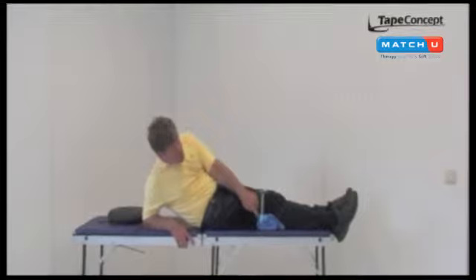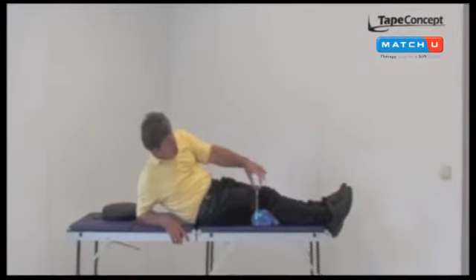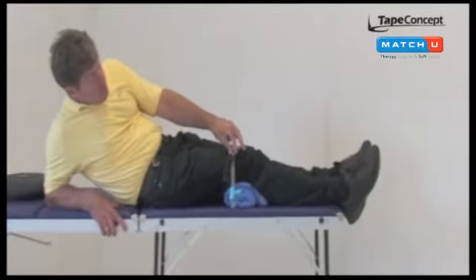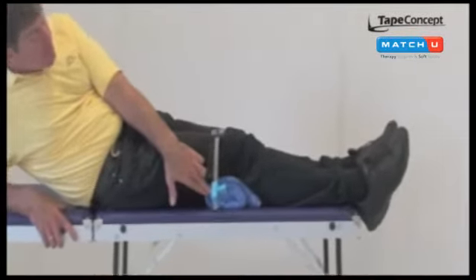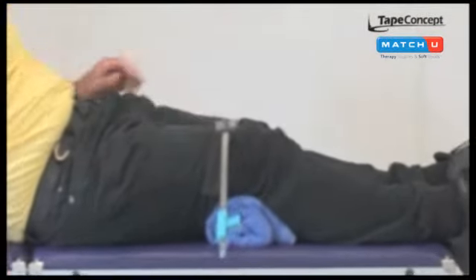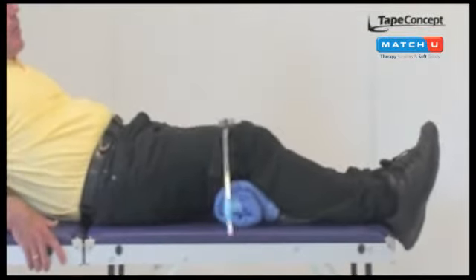A relaxation exercise for the knee: the strap is placed just above the kneecap, the towel is placed under the knee so that if you make an extension movement it's not painful, and the only thing the patient does is make this movement.